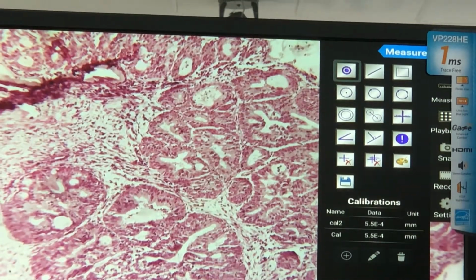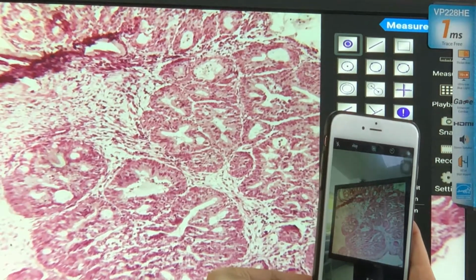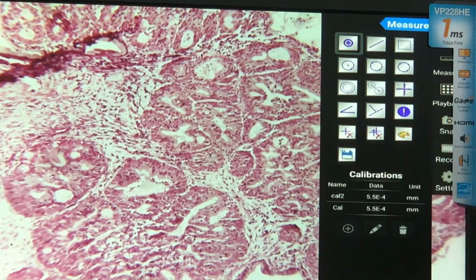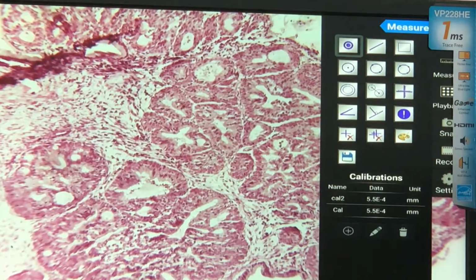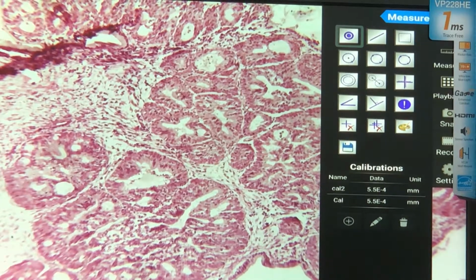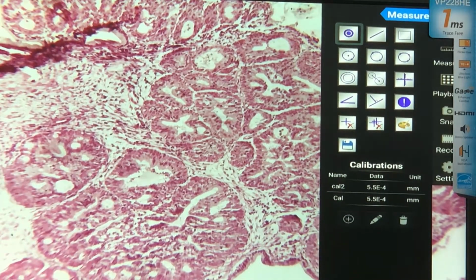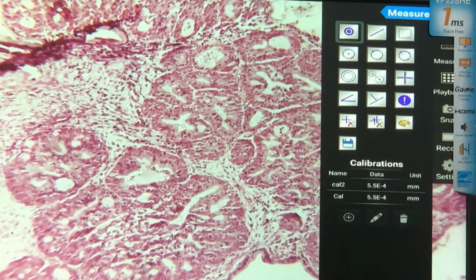So anyone who wants to become a gynecologist someday, in the practical exam for your residency, you will have this very commonly shown practical exam slide. So this is chronic endocervicitis. Now what is your basis for knowing this is endocervix?